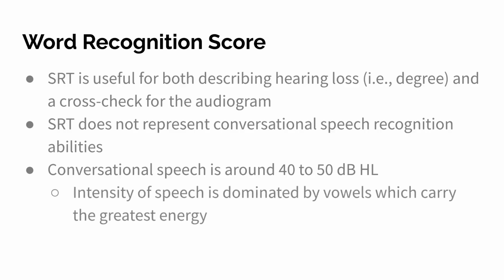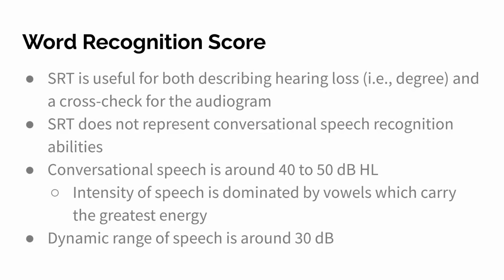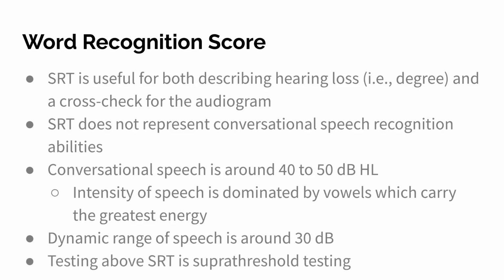Intensity of speech is dominated by vowels, which carry the greatest energy. The dynamic range of speech is around 30 dB. These are important little facts to know. Testing above SRT is called suprathreshold testing. I've already commented on that.